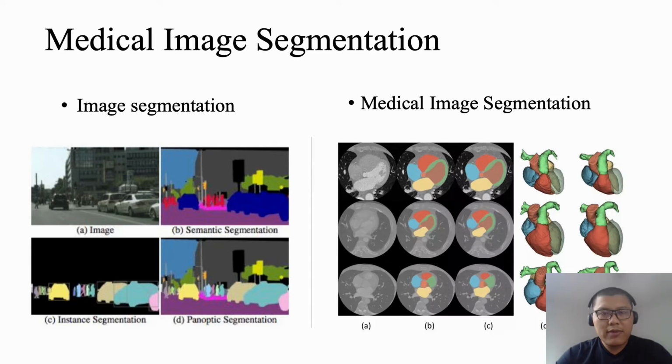Image segmentation is a very basic question in the field of computer vision. It is a pixel-level image classification method, popular in the area of computer vision. It converts input images into areas of interest with highlights. And medical image segmentation is a long-standing challenge due to problems like the limitation of labeled datasets, noise, and artifacts.